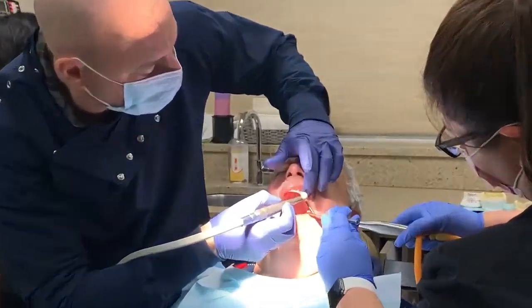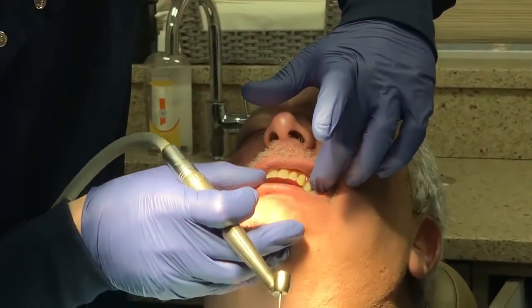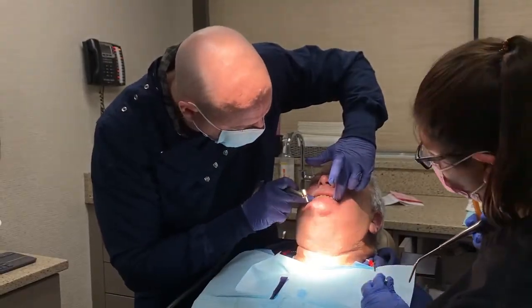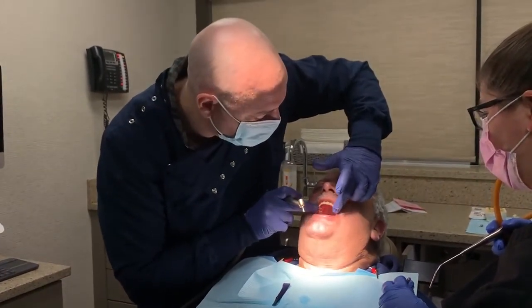And then we're going to take a bite. Okay. And bite down for a minute. Bite down. Don't feel high over there? Much better. Right? So, I mean, minor adjustment. It's nothing. Bite over here. Good. That's what I'm talking about. Okay. Another. And bite down.